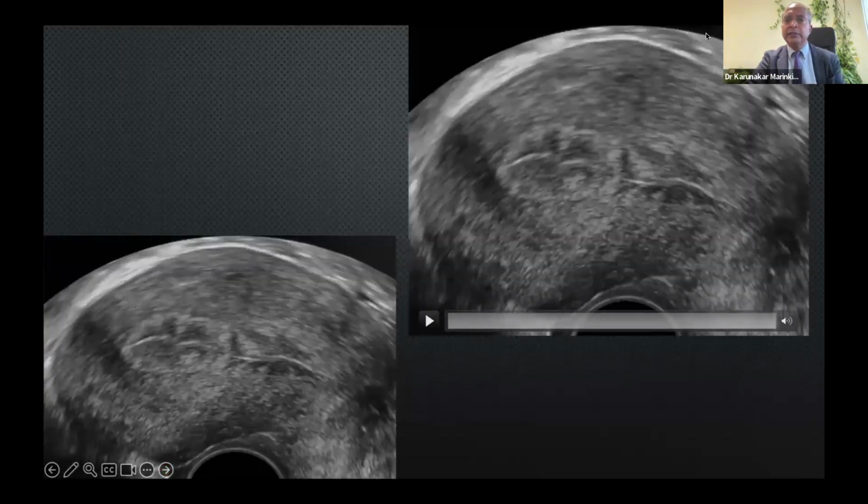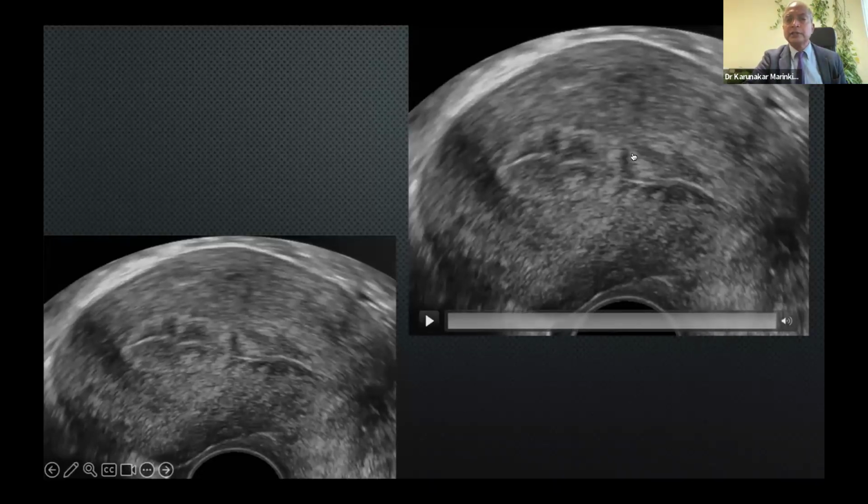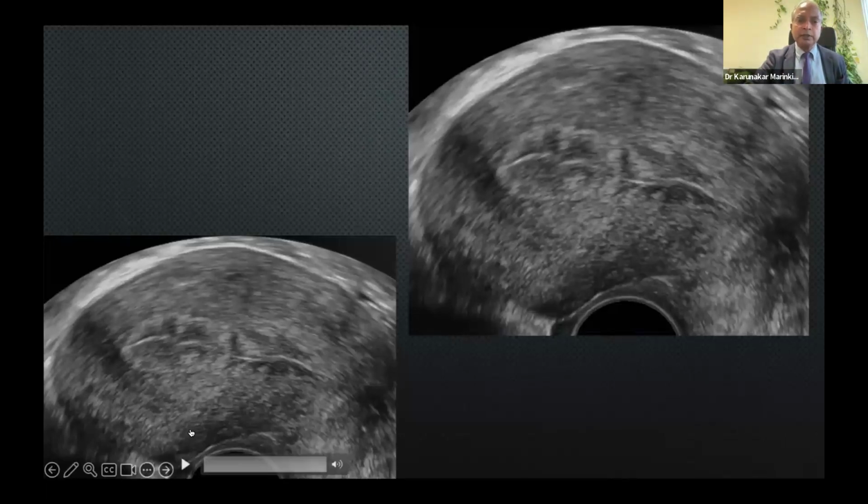This is endometrial waves. Maybe some of you know this, you saw it before. It's nothing but myometrial contractions, but seen as endometrial junctional zone contractions. This is nothing but labor pains. This is nothing but Braxton Hicks contractions. This is nothing but menstrual contractions. There are fundocervical contractions, and cervicofundal contractions that happen to facilitate the sperm being sucked into the fallopian tube. And the third one is circumferential contractions, that happen for expansion of the uterus when pregnancy is there. Fundocervical, cervicofundal, circumferential. And you can see them if you are careful.